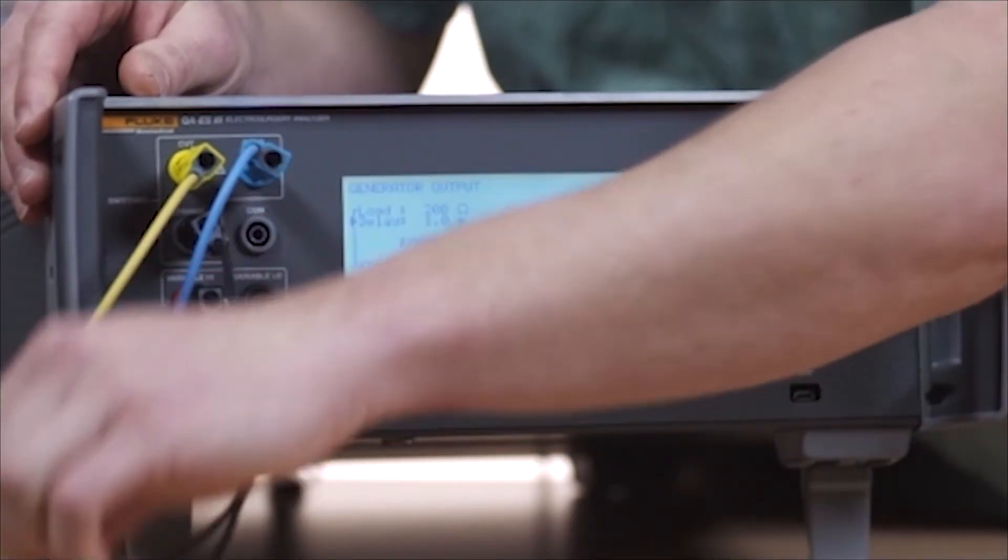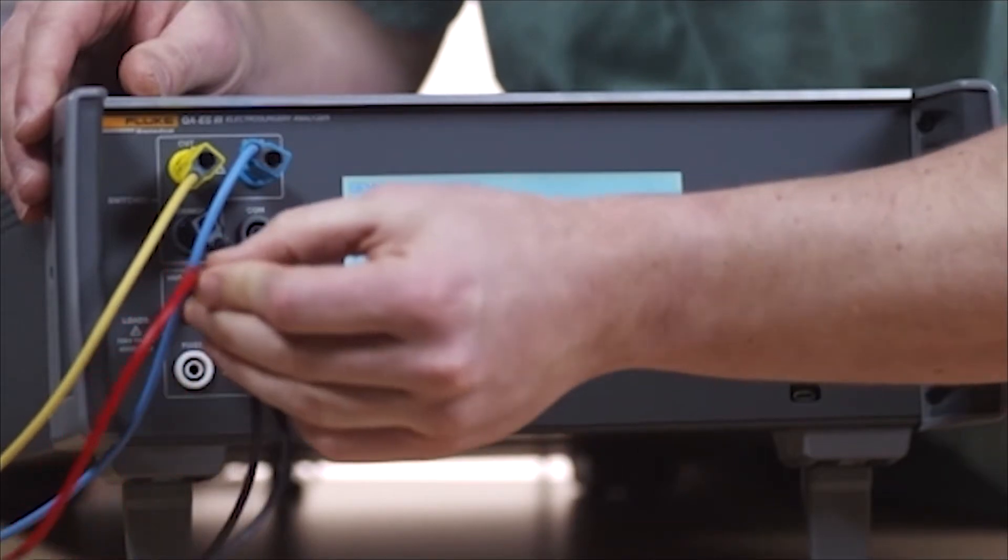Next, connect the ESU active electrode to the variable high-active electrode.